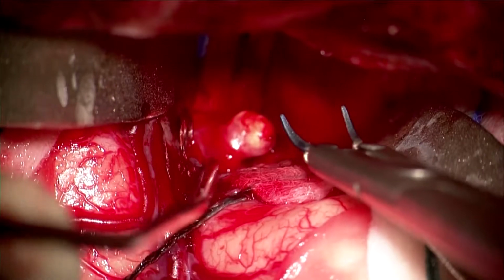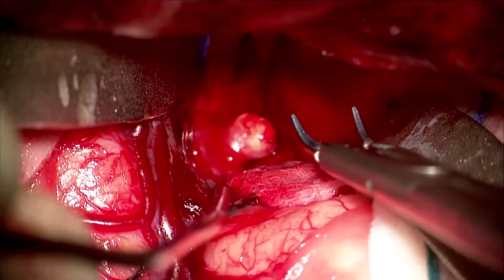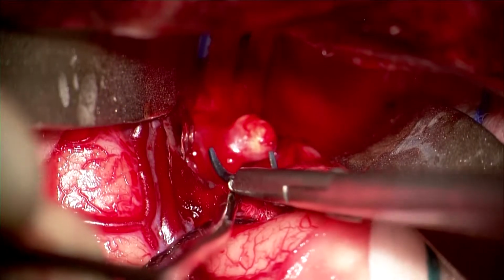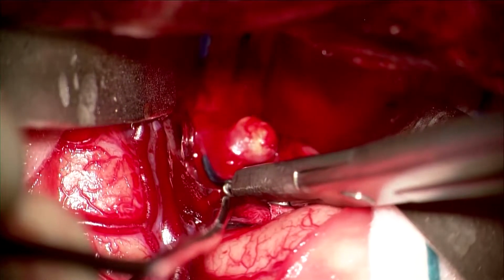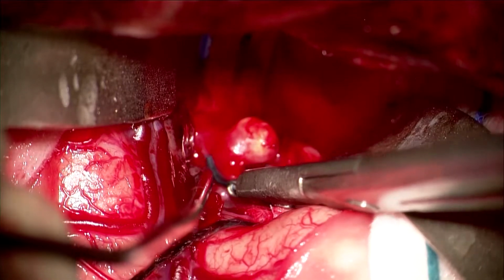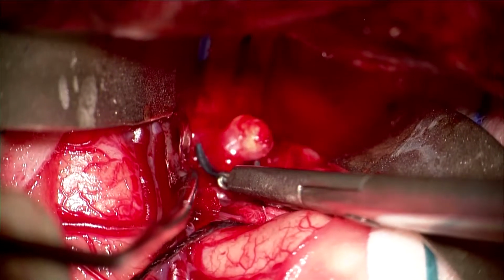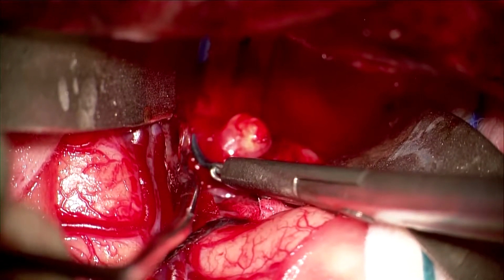So here, this is a slightly bent clip. There are many different shapes of the clips that we can use, and each aneurysm is individual. So you may think that you have something planned out before the aneurysm is exposed, but most times I end up changing to a different clip based on what is found during the procedure itself.